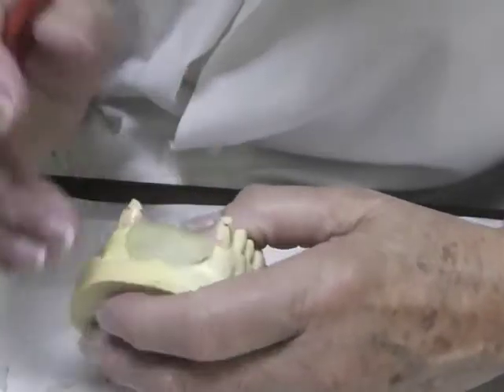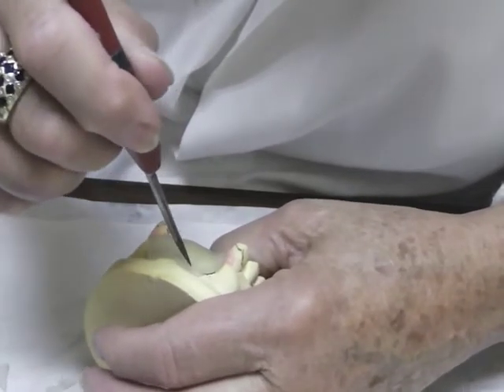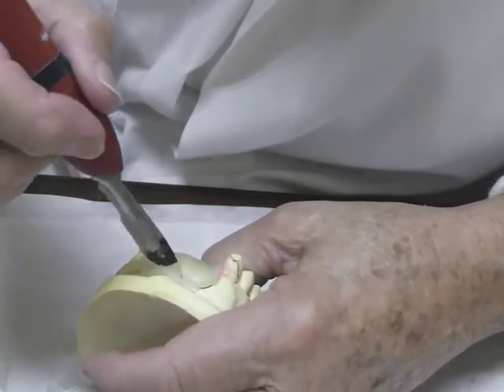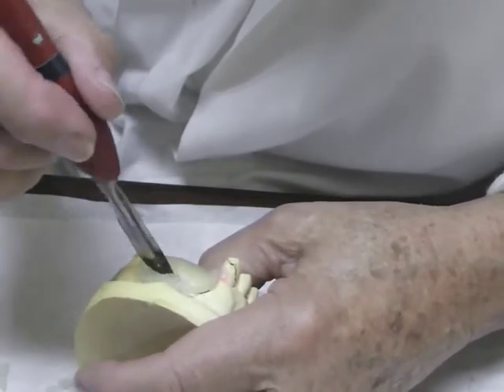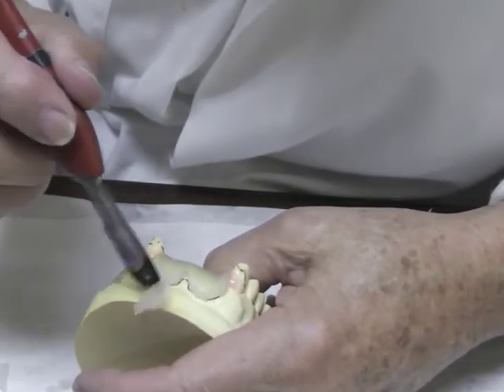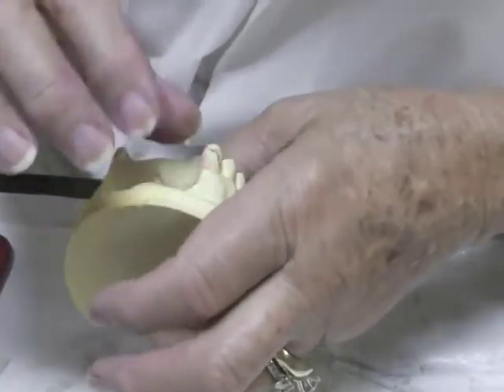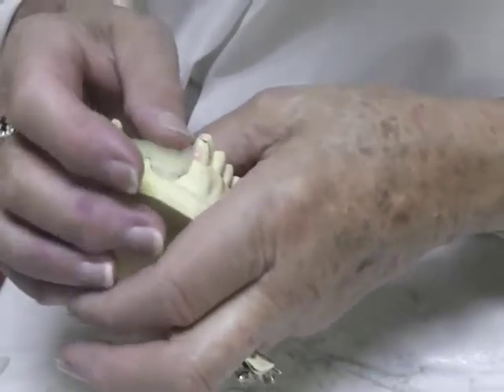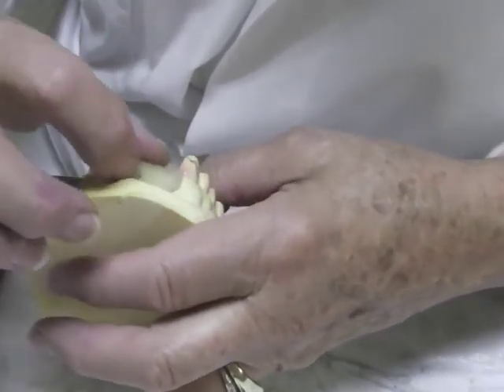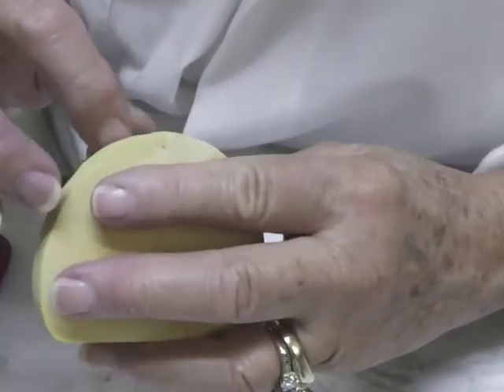I have a frenum attachment right there, so I'm going to come up three millimeters short of the depth of the vestibule. I'm going to come up around my frenum and bring this down to about three millimeters above the depth of my vestibule. It can be thin where you're trying to set teeth, but around these borders you want it to be a couple of millimeters in thickness.